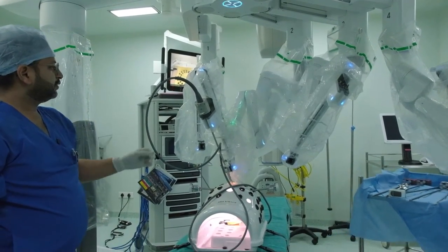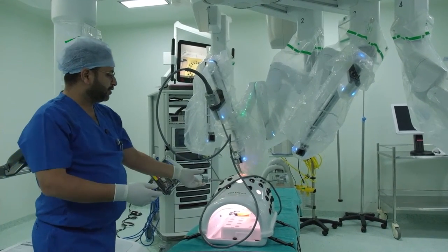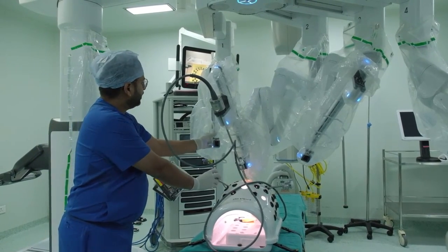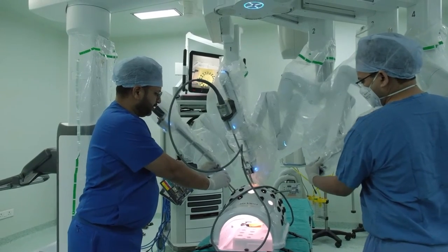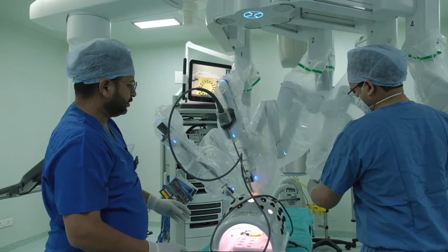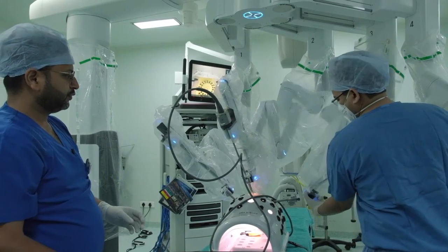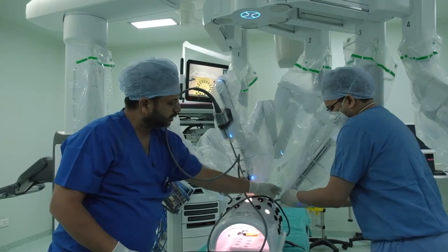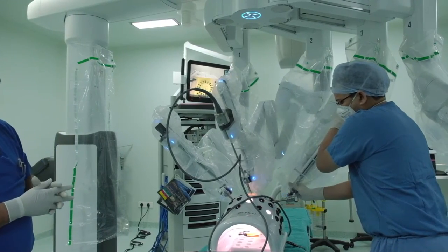Dock the remaining arms. Once the targeting is complete, now we are going to dock the remaining arms. So Dr. Tushar is going to dock arm number 3, while I am going to dock arm number 2. The docking has been made very simple in this particular system and it just takes a minute to dock the entire thing. There is a clip which can be pressed and it actually can be docked easily.